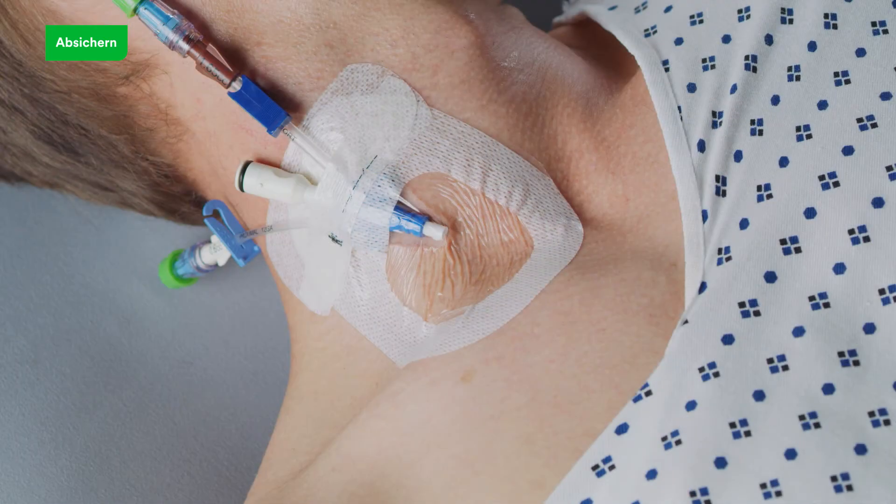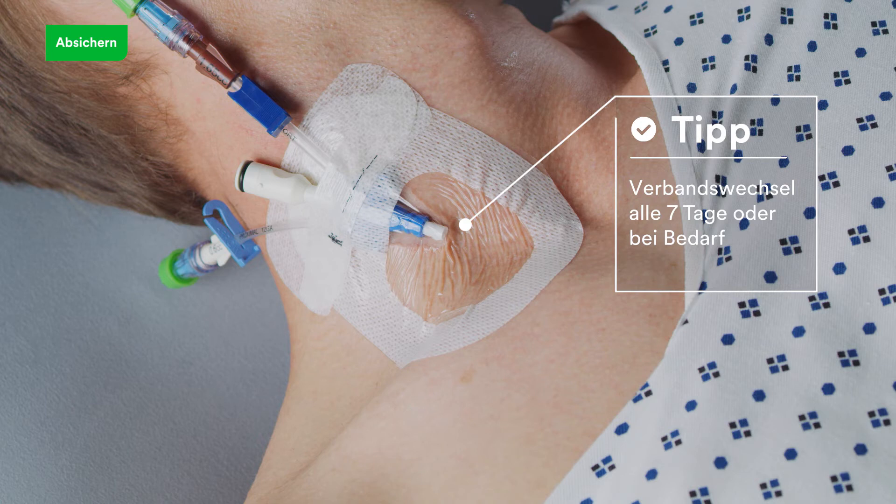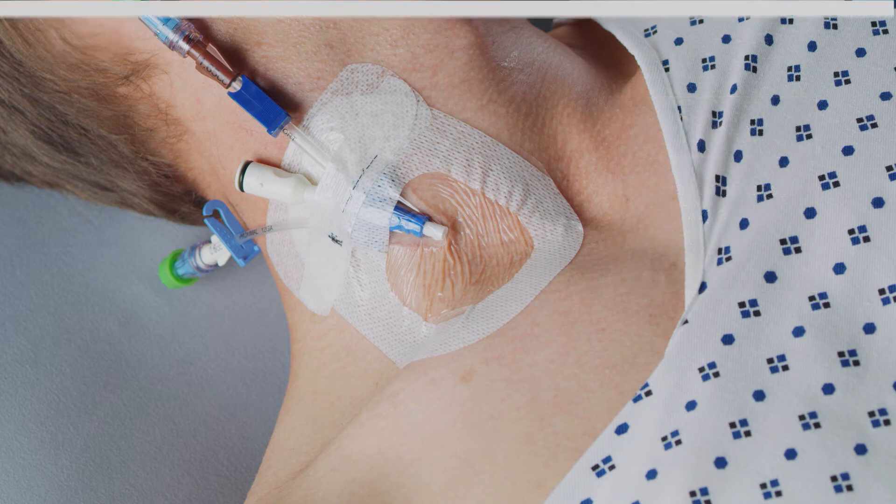Change the dressing every seven days, or when the dressing becomes loose, soiled, or damp, or according to facility protocol. Also change the dressing in cases of swelling, visible drainage, or lost visibility.